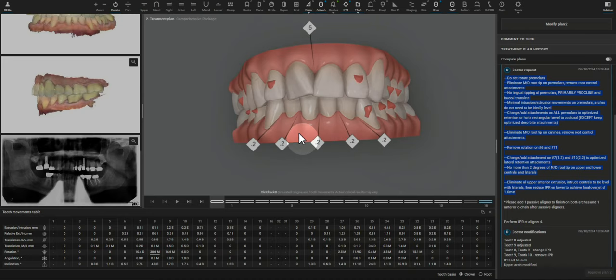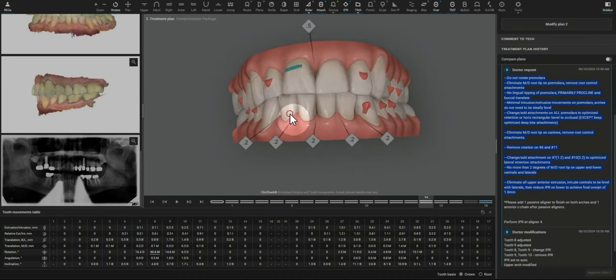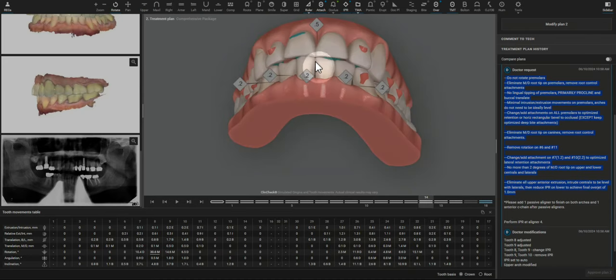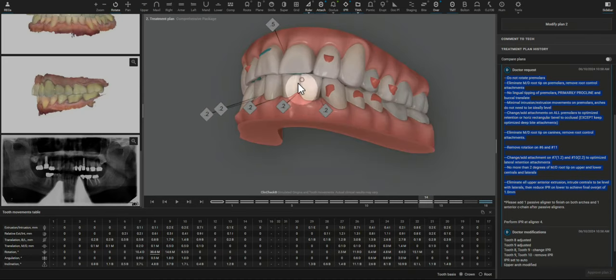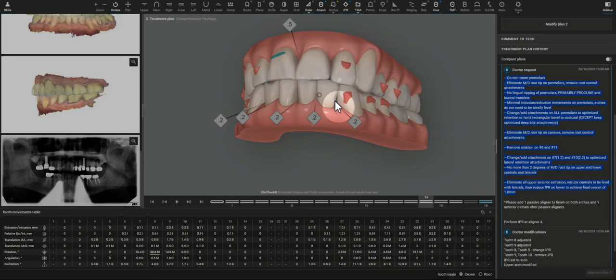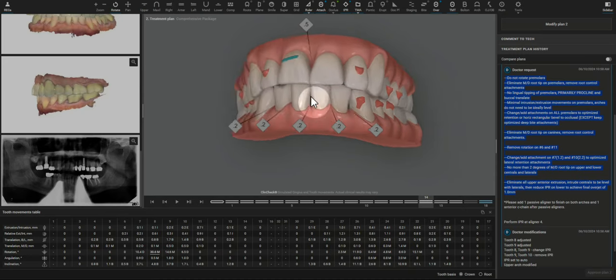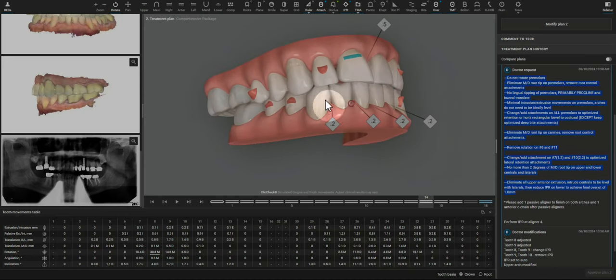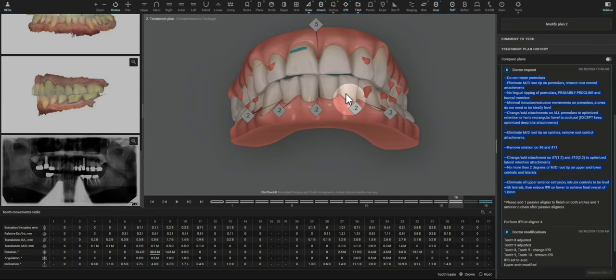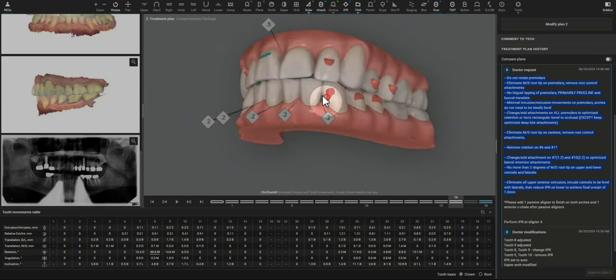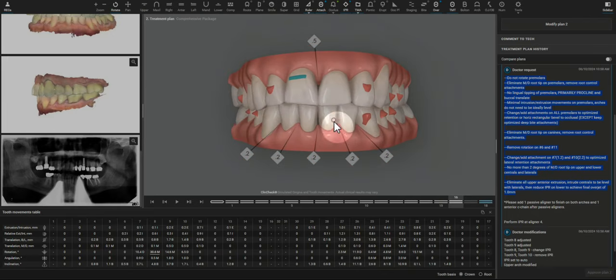Whenever there is some intrusion or a deep bite needed, I want to finish with more interoclusal space. So I'm going to increase the IPR in the areas where there are black triangles, just make it easier for myself to access as well as the finish for the patient.